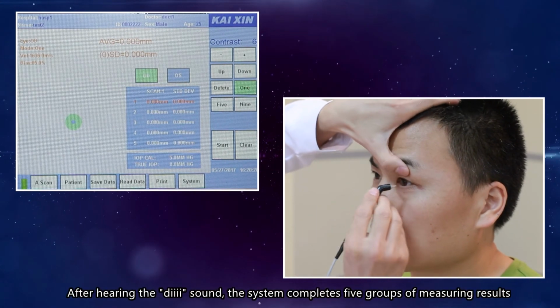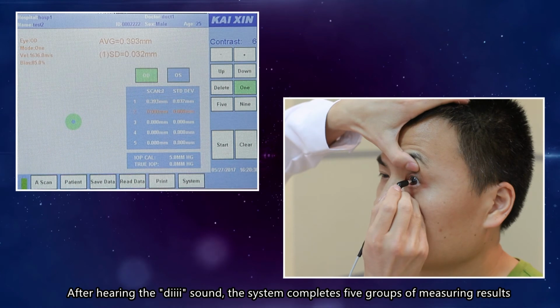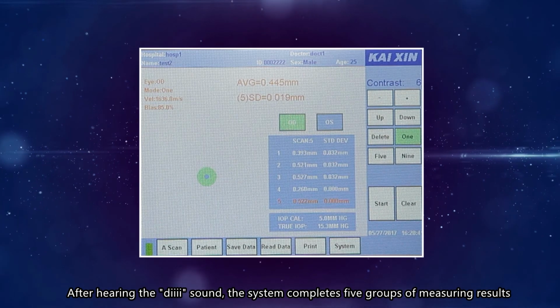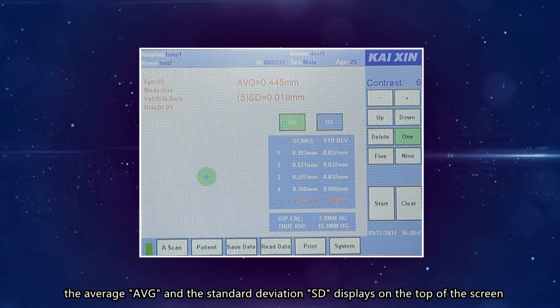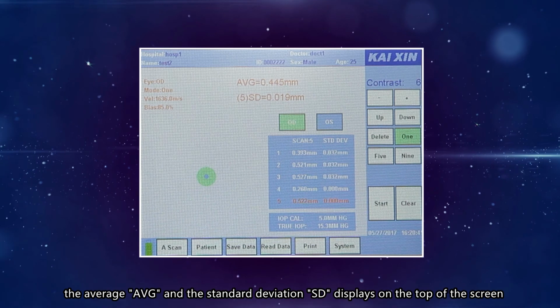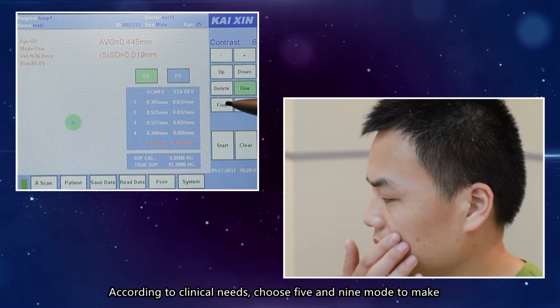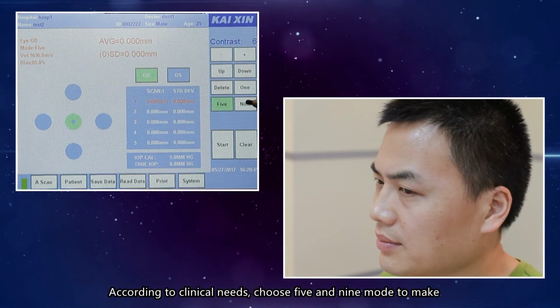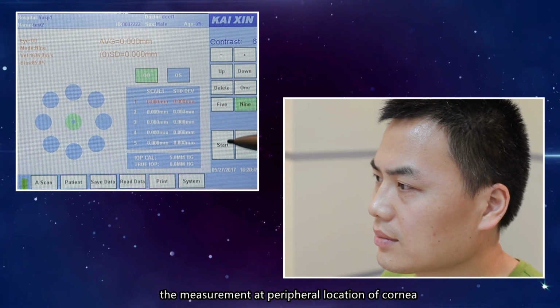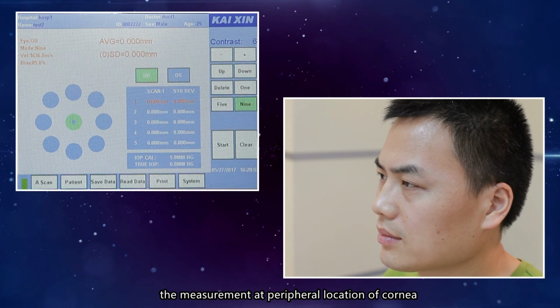After hearing the D sound, the system completes 5 groups of measuring results. The average AVG and the standard deviation SD display on the top of the screen. According to clinical needs, choose 5 and 9 mode to make the measurement at a peripheral location of cornea.